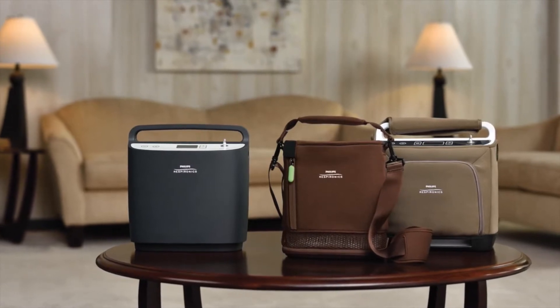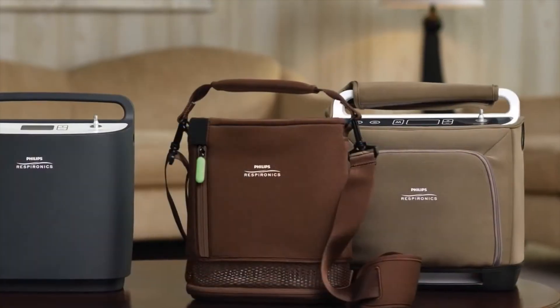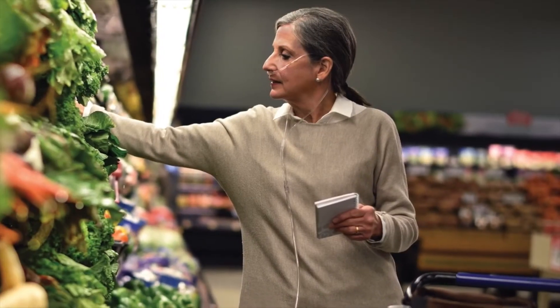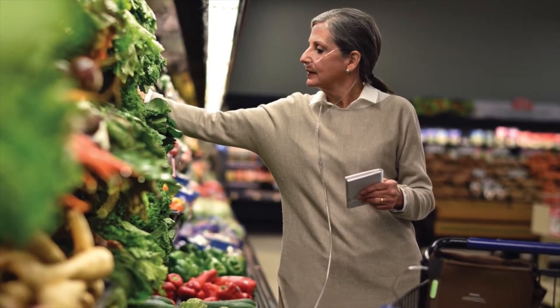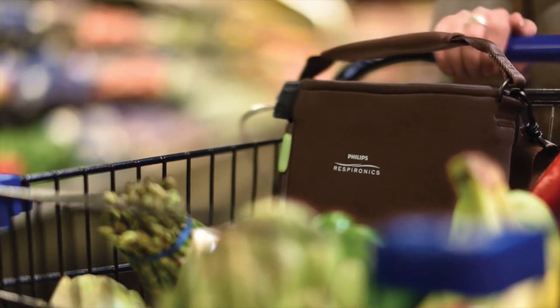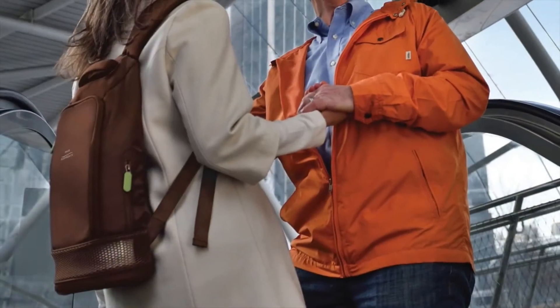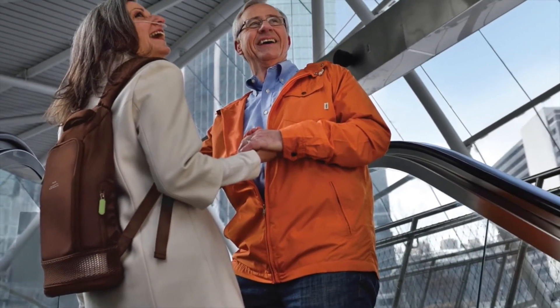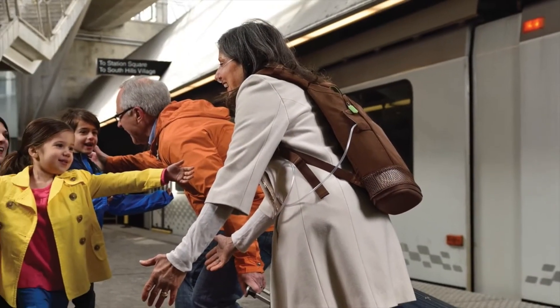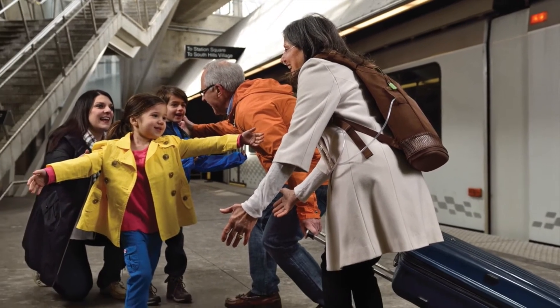Simply Go Mini is a powerful choice for a reliable and lightweight portable oxygen concentrator. Built to be tough, Simply Go Mini was rigorously tested in real-world environments to deliver reliable performance day in and day out. Easy to change, long-lasting batteries and standard AC and DC power cords provide you with the flexibility to be Simply Confident on the go.